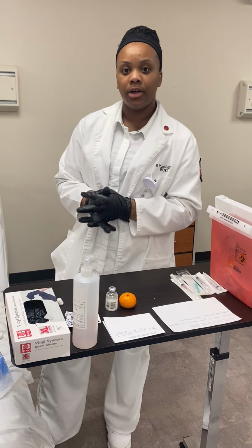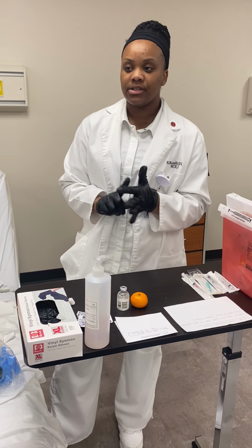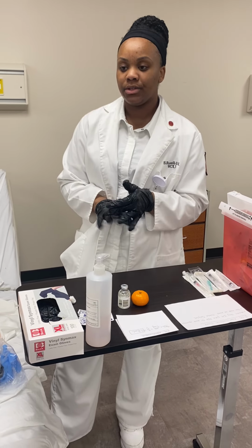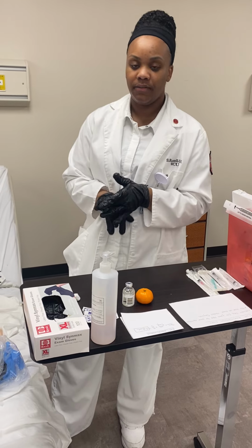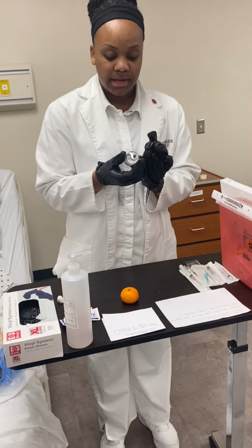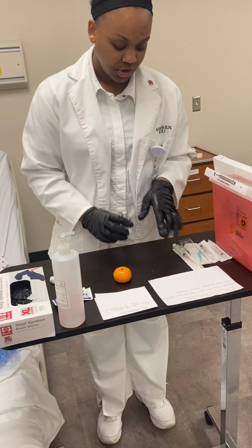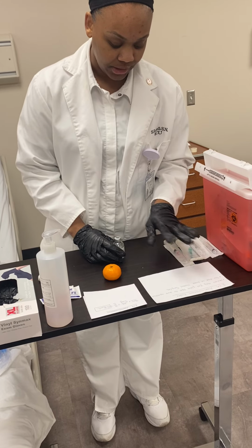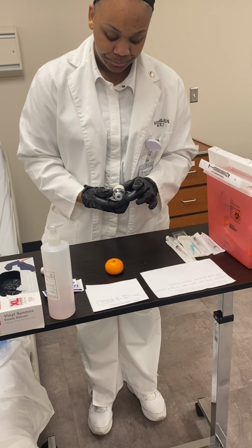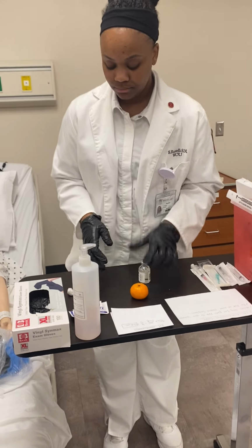And a few other IM sites that you can give medication in. There's deltoid IM, ventral gluteal, dorsal gluteal, vastus lateralis. So after I've done that, I'll have the medication pulled up here, and then I want to go ahead and just check it again against the MAR, making sure it's the correct medication amount. Then I'll check the expiration date, making sure that it hasn't expired.